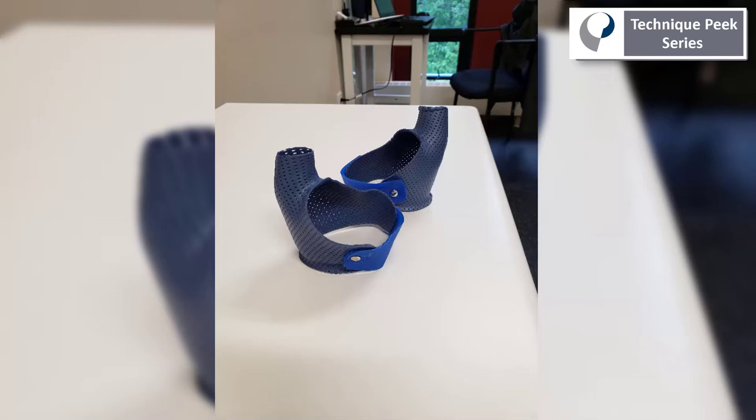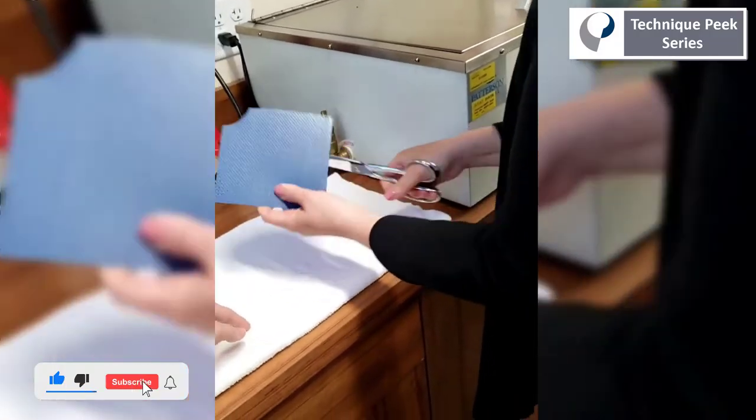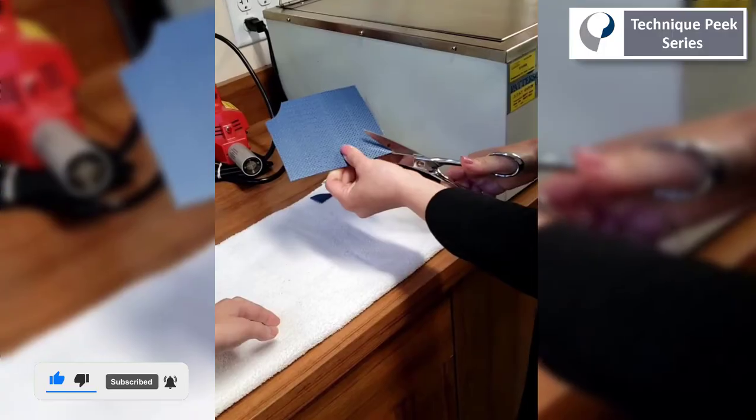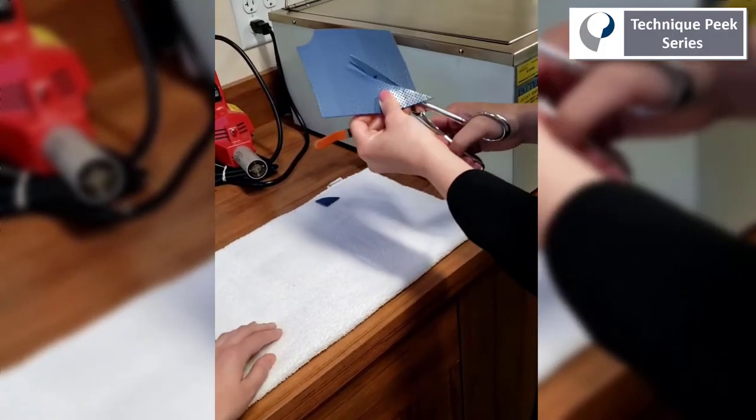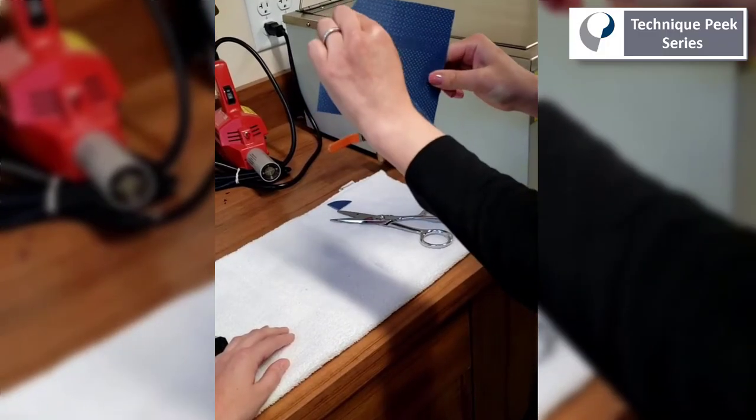Today I'm going to show you how to make a thumb spica splint in less than five minutes. We're using a small square of material, cutting a semicircle at the top, then cutting a line up to what is left being the width of the IP joint of the thumb.